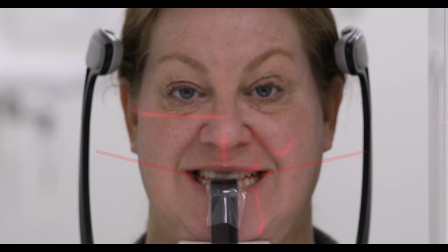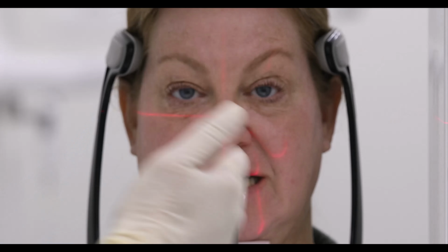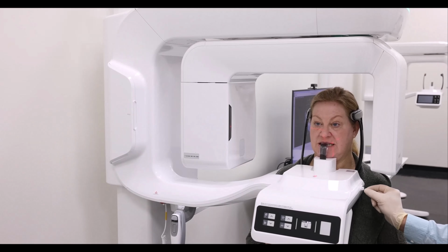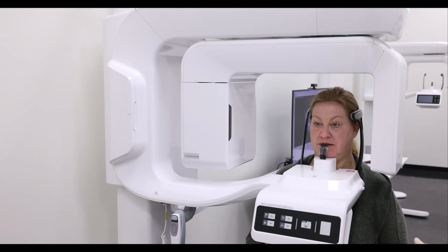Next, I'm going to go ahead and close my temple supports by clicking on the button here. Temple supports close, double check my mid-sagittal beam, and lastly we have our canine light. You can see it shining on the left side of the patient here. To adjust that canine beam, I can use our slide bar and move this anterior to posterior. Go ahead and smile really big for me. Perfect. All right, go ahead and relax your lips. We have our patient positioned. I'm going to go ahead and click on the check mark or the ready button here.